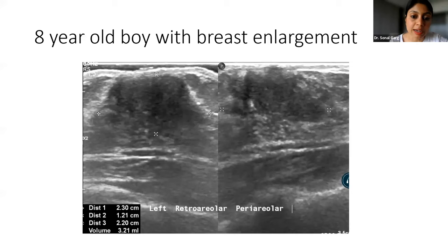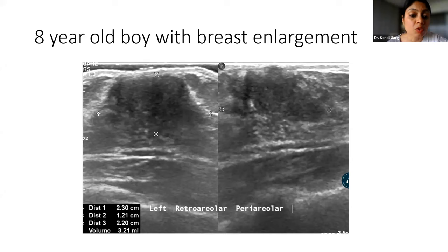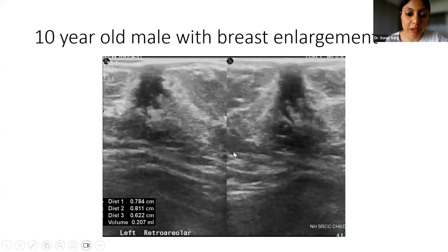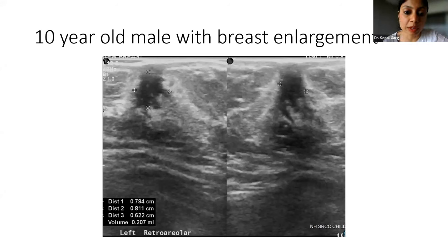There is a nodular type, a dendritic type, and a diffuse glandular type. I will show you what that looks like on ultrasound. This is an eight-year-old boy with breast enlargement — eight years is not the normal age for pubertal development in boys. This is a nodular pattern of gynecomastia where you can see a well-defined hypoechoic nodule. Similarly, this is a 10-year-old male with breast enlargement — again a very well-defined hypoechoic nodule.